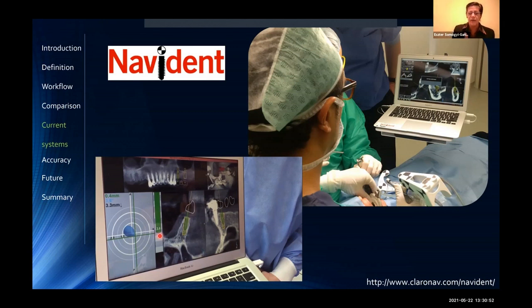then you go beep, beep, beep. And then when it's a continuous sound, you know that you reached your depth and you should be stopping. But this is the part that I was talking about.